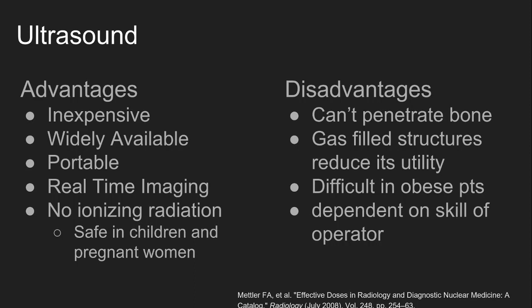Some disadvantages of ultrasound are that it cannot penetrate bone. Any sound wave transmission beyond the bone will be blocked, and the structures will not appear on the image. Similarly, gas-filled structures can decrease the utility of ultrasound. In obese patients, body habitus can impair the image quality. Finally, good ultrasound acquisition is heavily dependent on the skill of the operator.